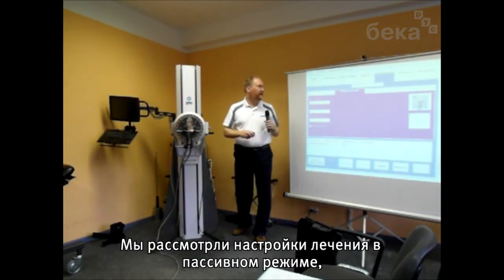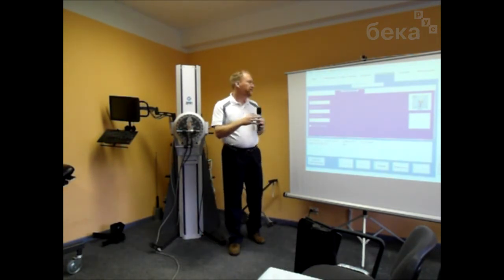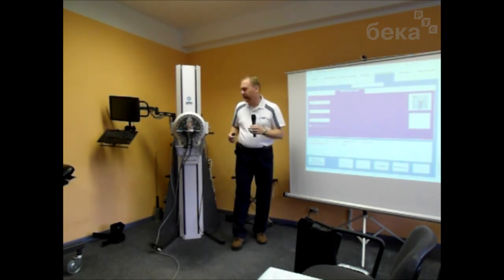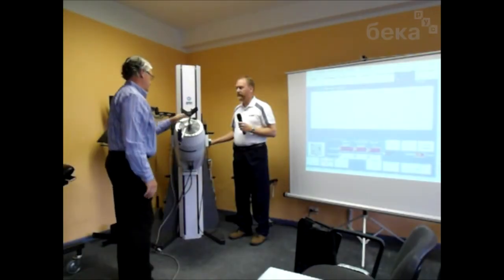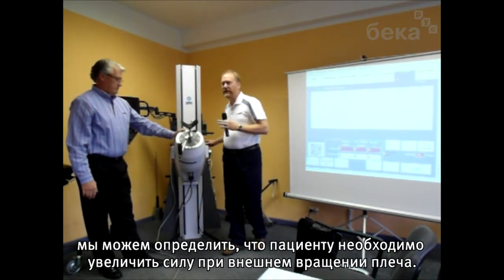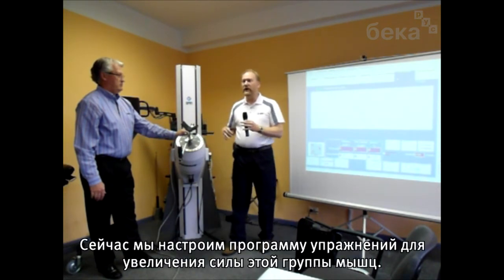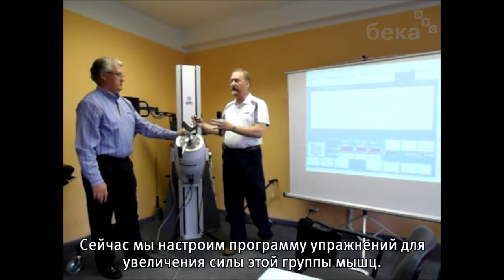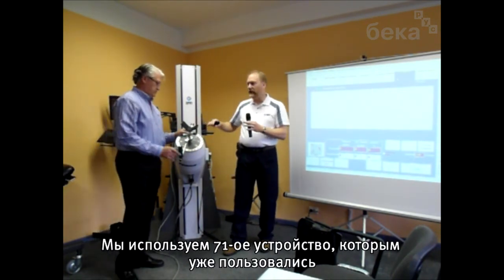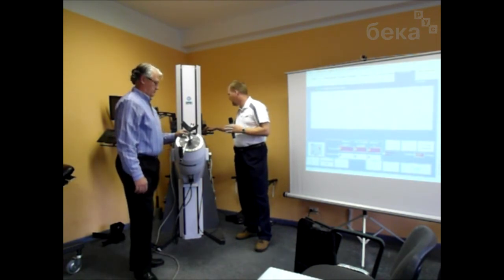So we've looked at the CPM setup and treatment, and we've looked at the isometric exercise and treatment. The next one we'll look at is isotonic exercise setup. Right, so based on our evaluation results, we'll say that we determined that this person has a strength deficit in doing shoulder external rotation. So now we want to configure an exercise program to try to increase the strength for that muscle group. We'll use the 701 tool that we've been using and put the lever length in there.